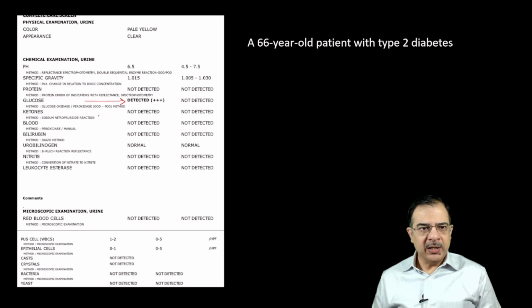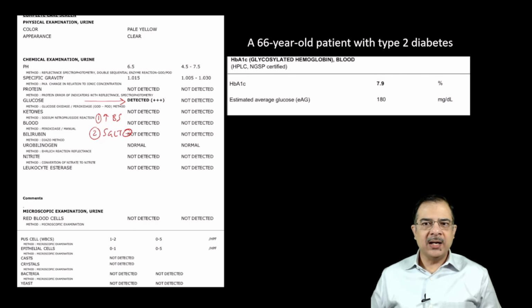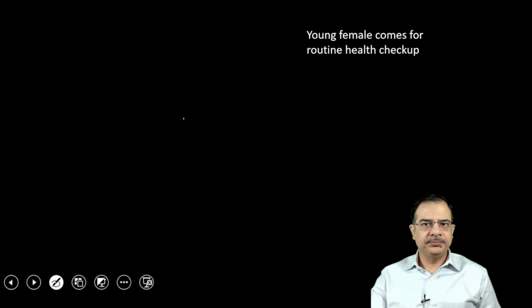Number one possibility is high blood sugar levels or uncontrolled sugars, or it can be because of SGLT inhibitor use. So when we asked the patient history, she was not taking an SGLT inhibitor and HbA1c was high, 7.9 you can see. So from that we can say that glucose positive is due to high blood glucose, uncontrolled sugars.